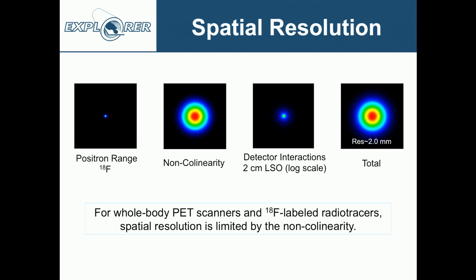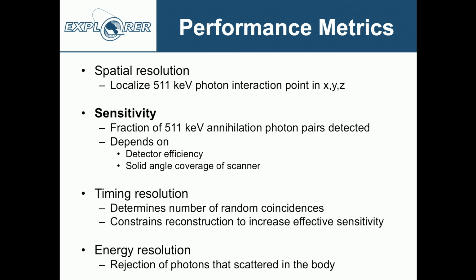Now, clinical scanners today are not at this level of resolution. They're typically in the 4 to 6 millimeter resolution range. And one of the reasons that there hasn't been a great push to improve the spatial resolution further, even though we have detector technologies that are capable of it, is really that we don't generally have the underlying counting statistics to support that level of spatial resolution.